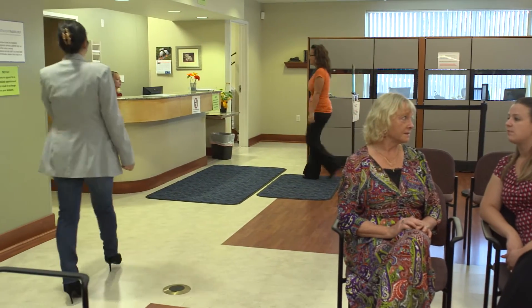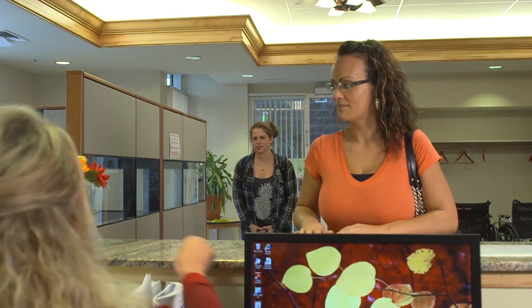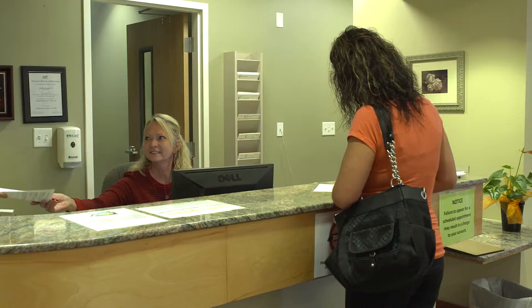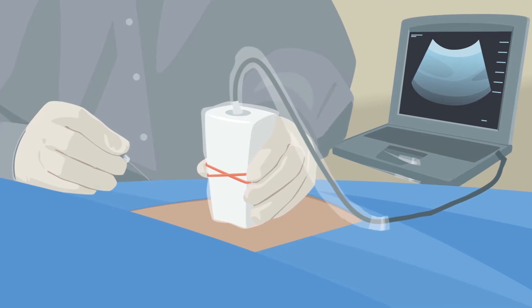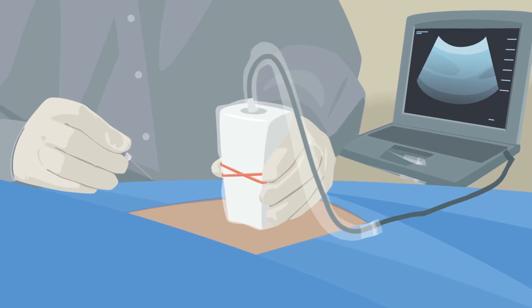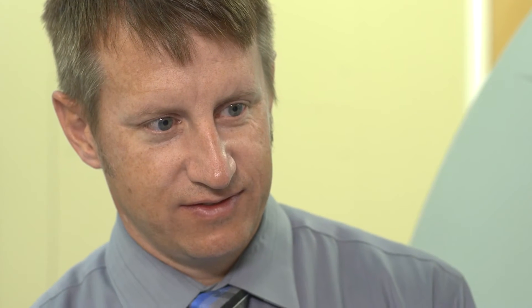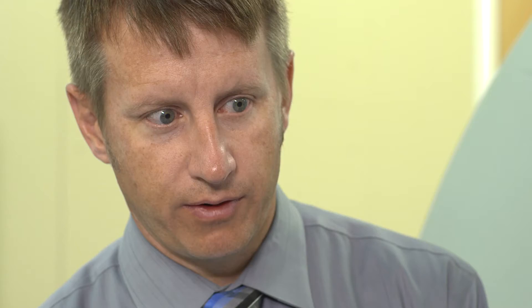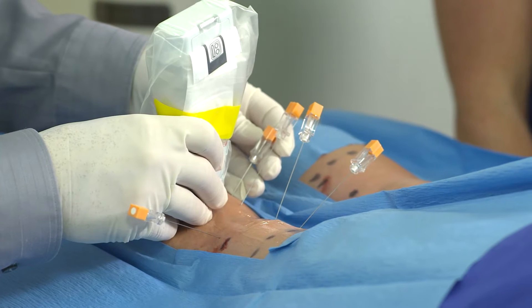While the use of ultrasound accelerates clinical workflow, traditional ultrasound presents some challenges that the AccuSone Freestyle ultrasound system mitigates with its wireless transducers. When you're doing a musculoskeletal procedure, sterility is of concern. With a wired versus a wireless system, if you have a cable, you can inadvertently touch a portion of that cable that's non-sterile. You can drag across your field inadvertently. With the AccuSone Freestyle, you prevent all of that potential cause of concern. The cable-free system allows me to put the probe on the sterile field directly while I'm preparing my next injection or my next procedure.